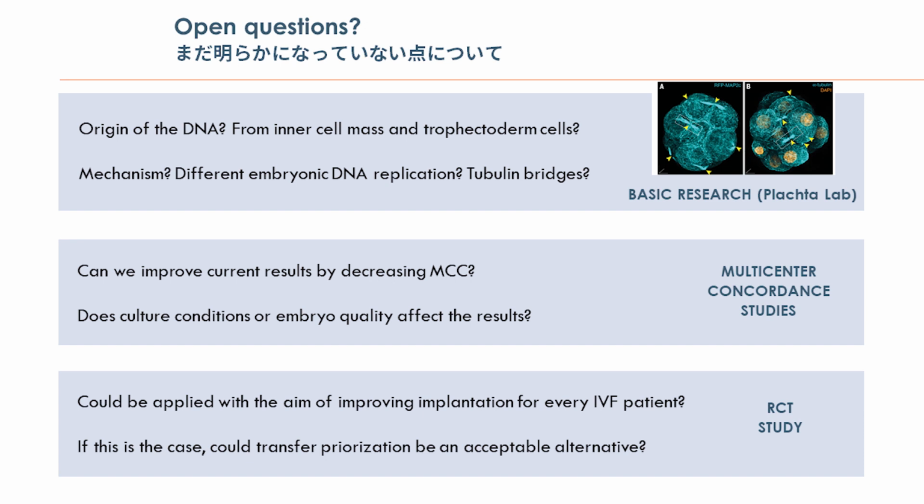But we wanted to see if this approach can be a general approach for every IVF patient, if we can analyze the media to improve clinical outcomes for every kind of patient. More or less the same approach as time-lapse or embryoscope, which you apply to every patient to see if you can increase implantation rate, using this as an additional selection tool.